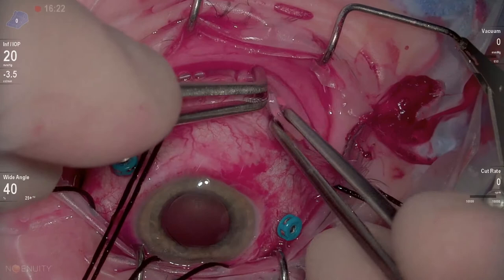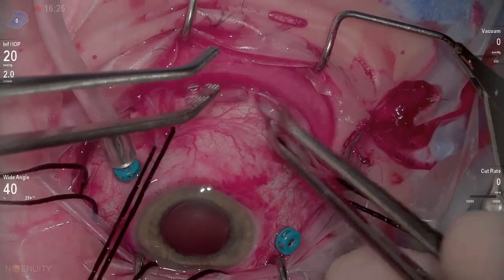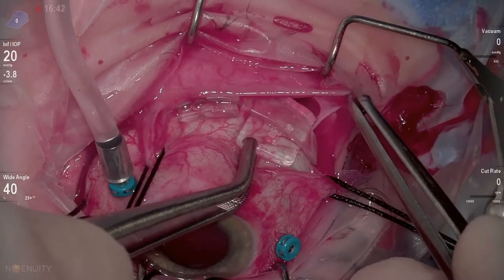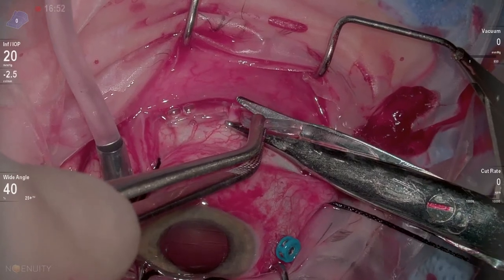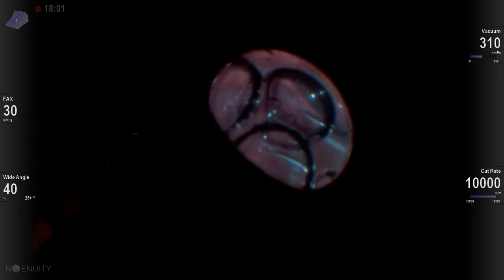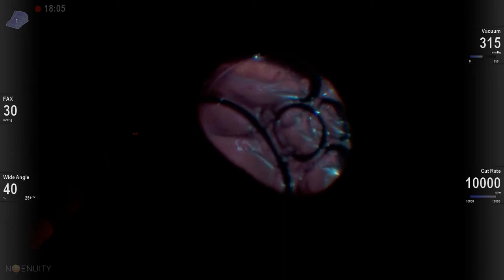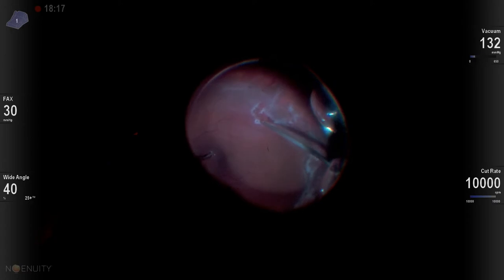When I went back in the eye, I found that the traction wasn't adequately supported in that area, so I placed a second 106. I debated taking out my scleral belt loop, but I left it in place, and it actually worked out really nicely. Here we are trimming off the anterior edge of that 106, and now as I go back inside the eye and perform an air-fluid exchange, I have really good support on the anterior aspect of the tear itself.